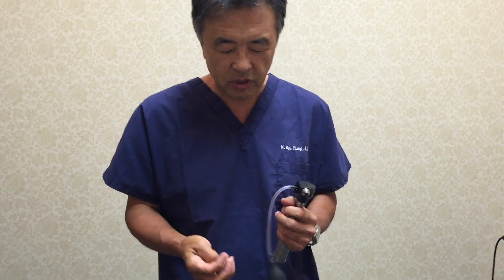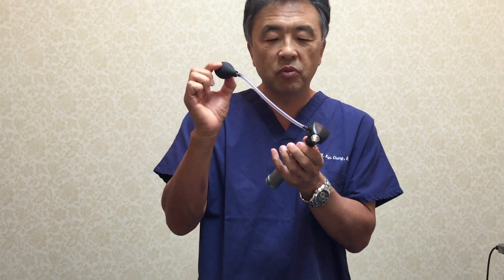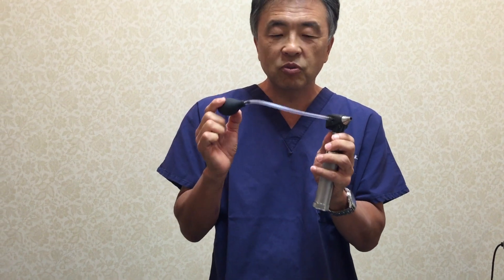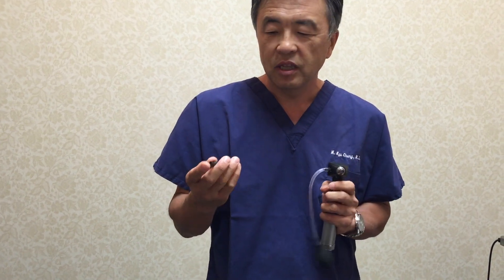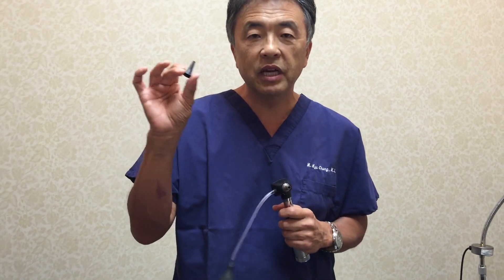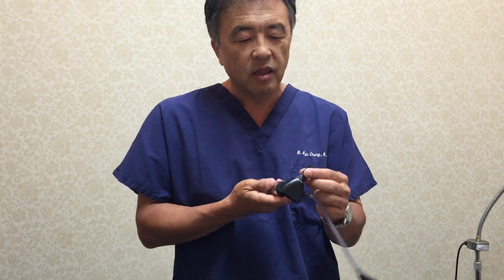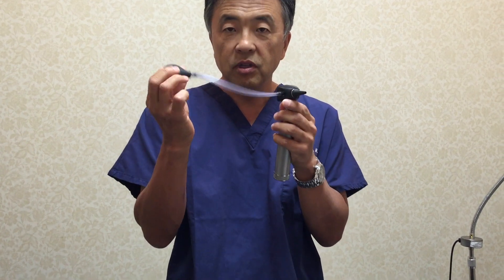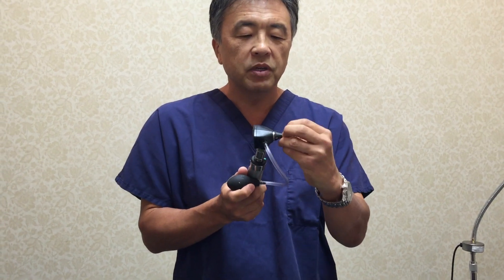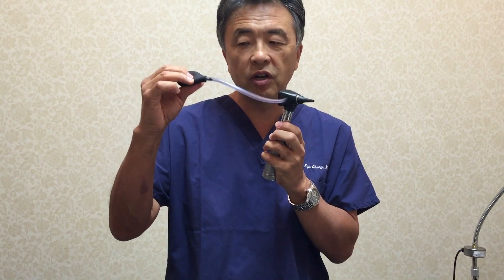The number one thing I want to show is that a lot of people don't use the pneumatoscope portion, partly because they weren't trained and also because they can't seem to get a good seal on the ear. So when you're using this scope — typically people have these in the office — the problem is they do not fit the ear canal, so when you use this little pump here, because there's no seal, you can't get the eardrum to move unless you press very hard.